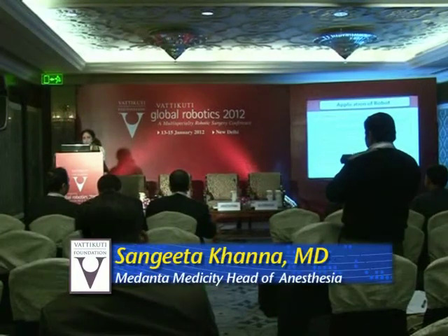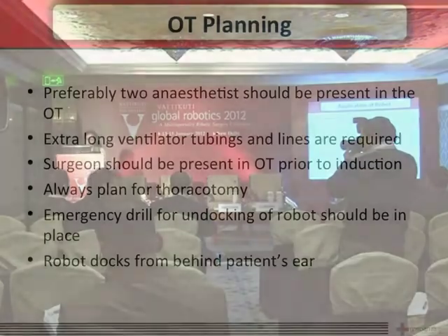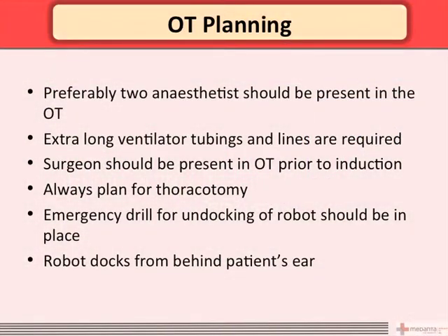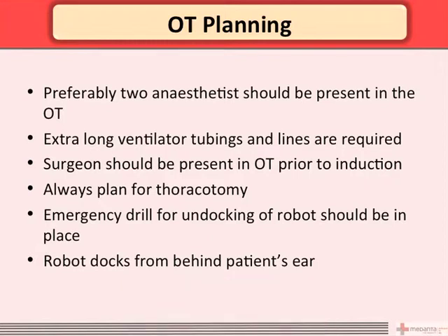We always prefer to have the surgeon in the OT prior to induction. A few things which help us are, one, we know the right site has been marked. Secondly, quite a few surgeons prefer to do a bronchoscopy before doing a lobectomy or a pneumonectomy. So, we want to put in a single lumen tube, do the bronchoscopy, and then change the tube to the double lumen tube if required. And then during positioning, it's always better to have the surgeon in place because you don't want them coming afterwards and telling us that the position is not right. I mean, you need to change everything after your positioning and all the lines are in place.